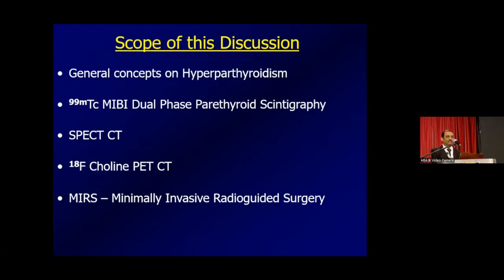We do routinely the SPECT-CT, and also for some specific patients where we are always getting the conventional sestamibi scan negative, but there is a high clinical chance to have hyperparathyroidism, we do 18F labeled choline PET-CT also. I will also be introducing you to a very new, excellent concept, minimally invasive radio-guided surgery, which we routinely do in the last 12 years.